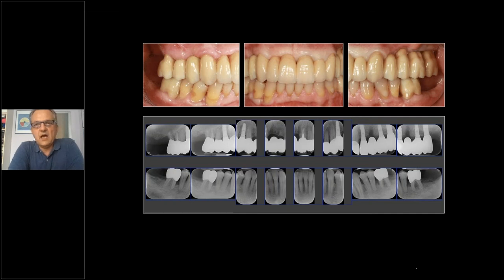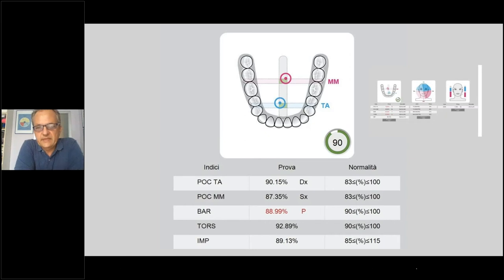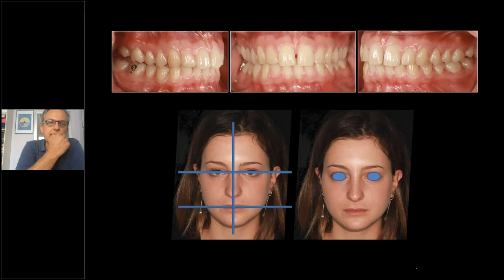And of course, at the beginning, it didn't make much sense to test the neuromuscular balance of this patient. But at the end, we see that this is just the day of the delivery. All the values are looking quite good, and so I'm quite pleased about that. But we have to still keep in mind that this is not the only point that we have to look at.